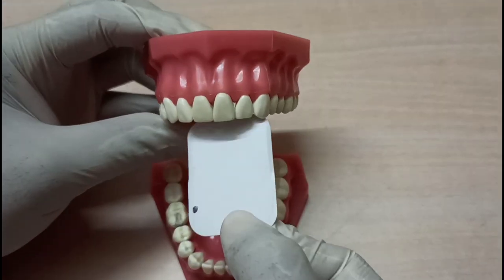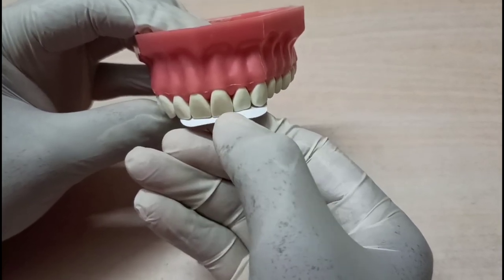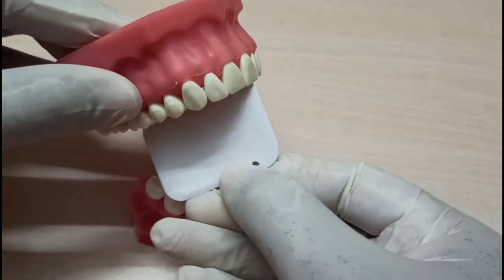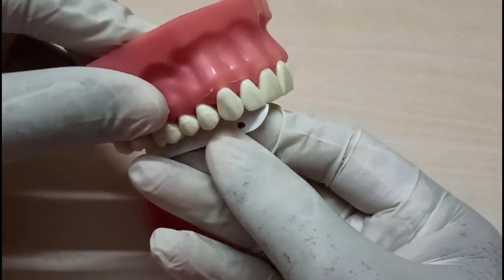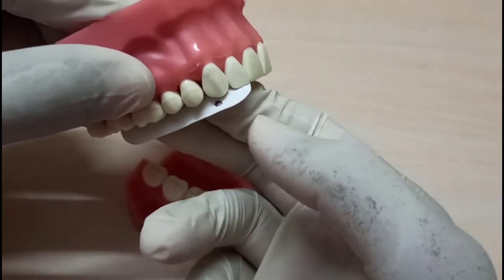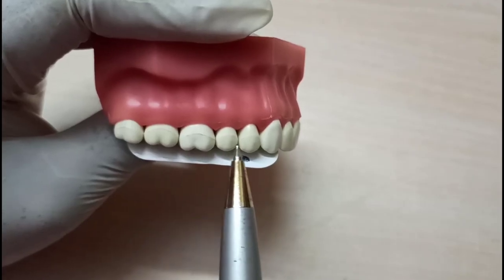For anterior teeth the film has to be placed vertically and the edge of the film should be 2 to 3 mm extending from the incisal plane. For posterior teeth the film has to be placed horizontally and the edge of the film should be 3 to 4 mm extending from the occlusal plane. The edge of the film should be parallel to the incisal and occlusal plane.